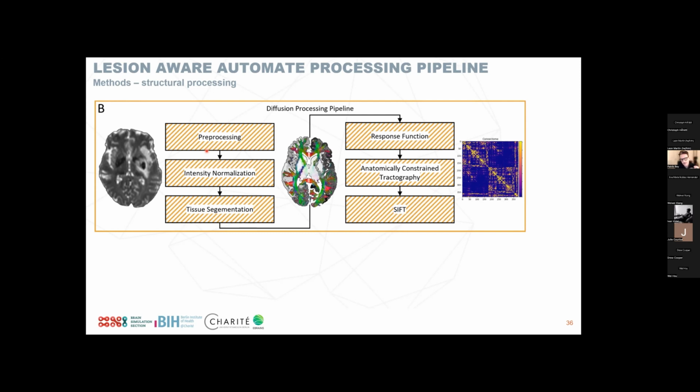And then you acquire the same data, but now you inverse the phase encoding direction. So now you have the exact same distortion in the opposing direction, and then you can use the idea of these reverse directions actually canceling each other out, so that at the end you get a nice clean approximation of the actual data. We don't even have this type of data, so we weren't able to use this.